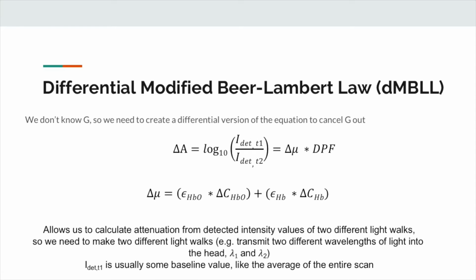And then the light intensity at T1 and T2 both matter, and T2 would be whatever this moment is, and then T1 is typically regarded as some baseline value. In a lot of the software packages that I've worked with, that's kind of an average light intensity over the entire course of the run. It doesn't really matter what you use as your baseline value because we're not caring about the absolute concentration values that we're calculating from this. We're caring about changes in concentration. And so what it's changing from doesn't matter so much. It just might be important to know how your software is calculating it.